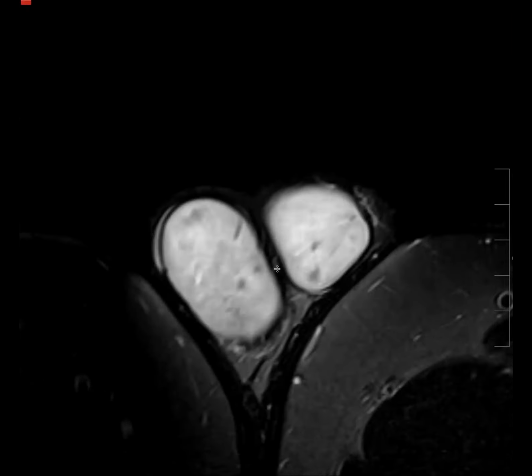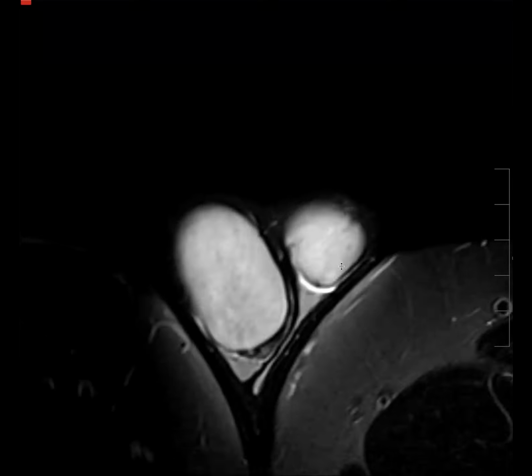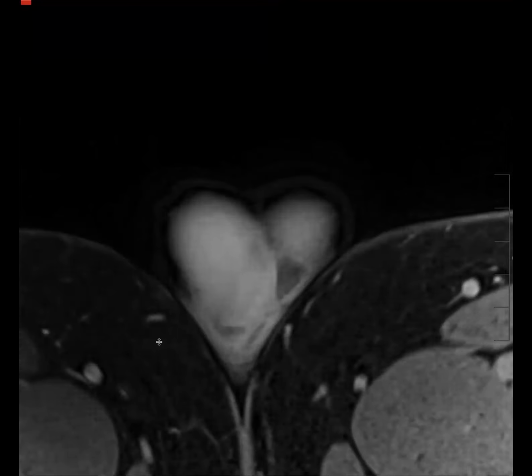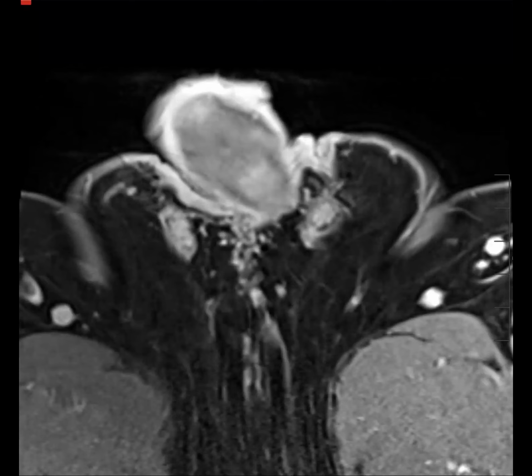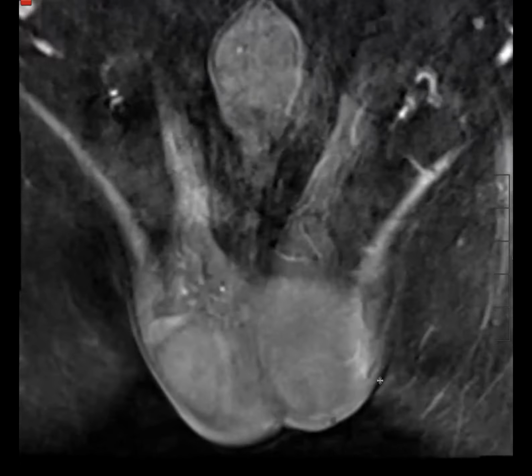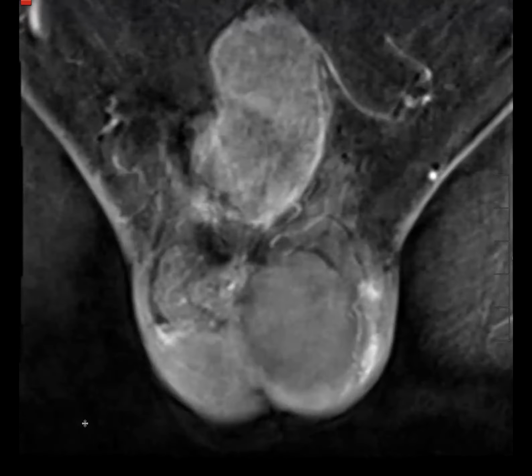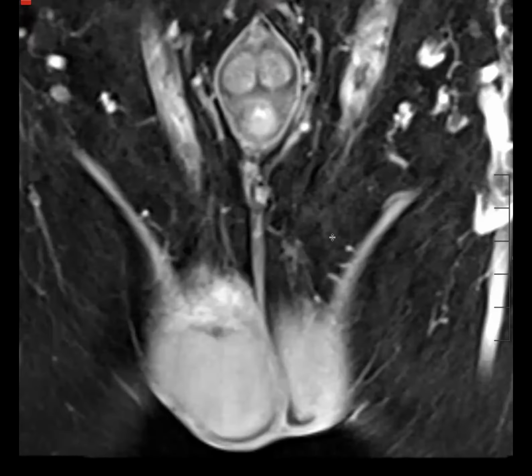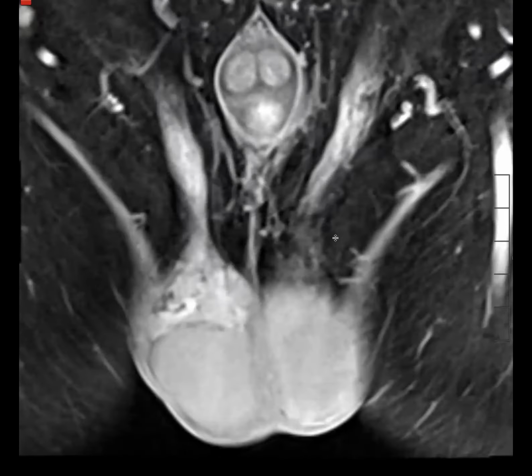So there's more than just one. There's actually multiple bilateral T2 hypointense lesions in the testicles. And we have a post-contrast sequence. So let me see now. Here is 30 seconds fat sat. Not really convincing enhancement. And then here's 5 minutes. Pretty homogeneous. Here's a subtraction.